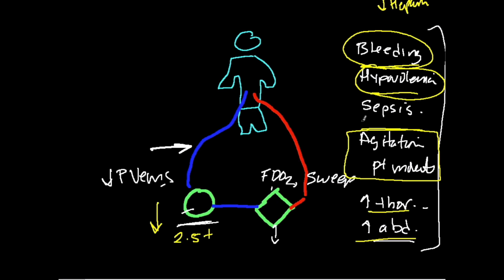So I think these are some pretty generic items that are germane to any kind of ECMO system, whether it's a VA, VV, or one of the hybrid systems. These are just problems that permeate the whole technology and the whole interaction between machine and patients. There are definitely some particulars of VA and VV that deserve some attention on their own, and those will be covered in separate modules. Thanks.